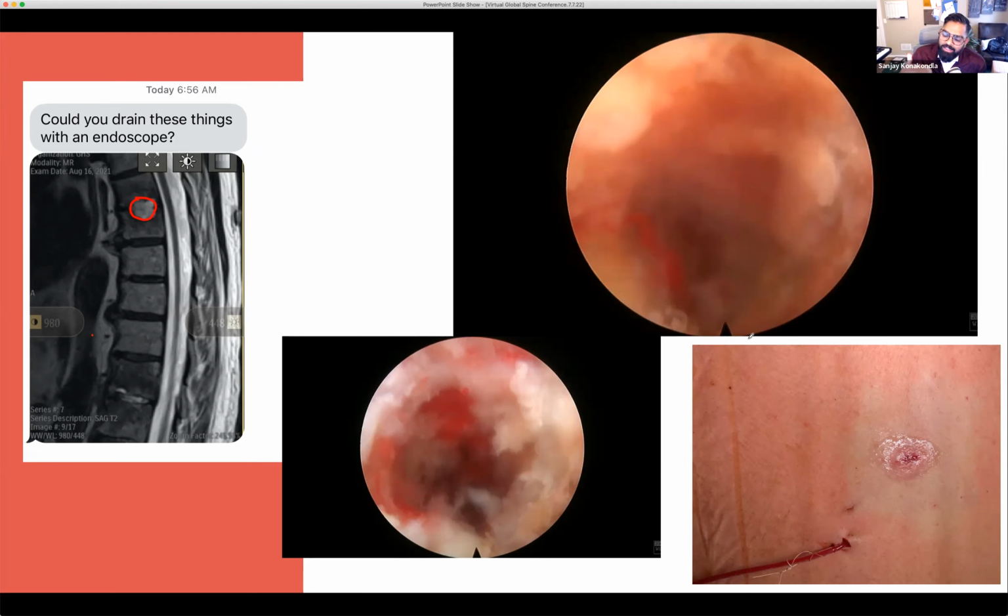It really depends on what bed you're using, the position of the patient, how high the bags are compared to where your hands are and where the scopes are. So that has a lot of implications, where the heart is based on the blood pressure. But I think the thing that I just keep in mind is don't take it too high. I don't really have those nuanced changes for thoracic versus lumbar.